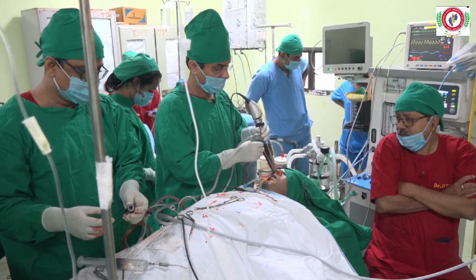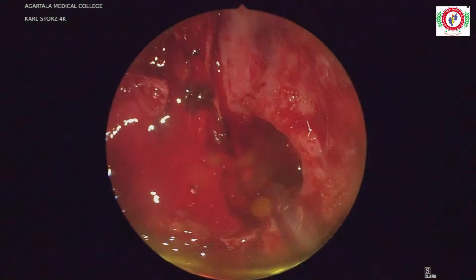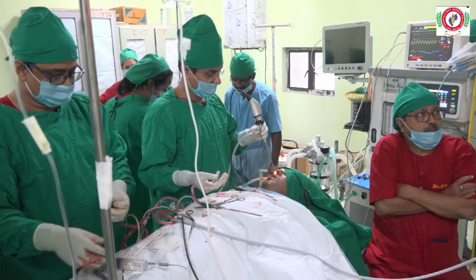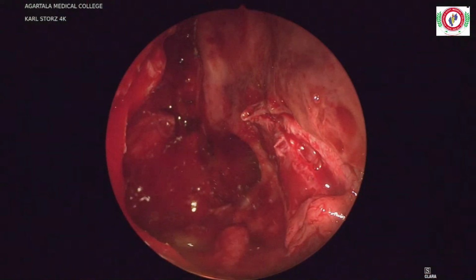Debrider again is not working. What's the problem? Give saline. Check whether its suction is working or not. So we are having a trouble with the debrider today.